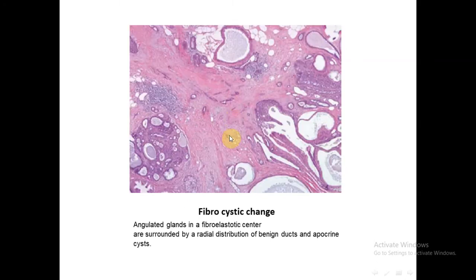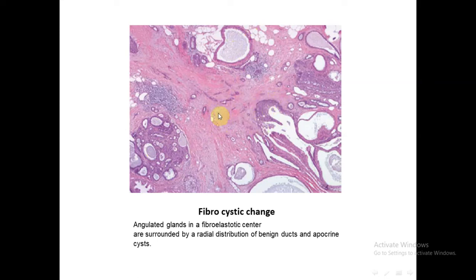Microscopically, fibrocystic change can be of a non-proliferative type or proliferative type. Here we have a proliferative fibrocystic change with multiple dilated cystic structures lined by epithelial cells which show proliferation and presence of myoepithelial cells. Here we have the stromal fibrosis. This is proliferative type fibrocystic change.